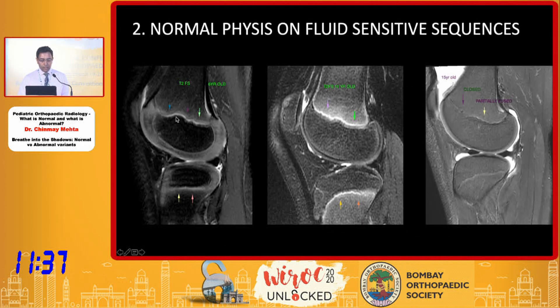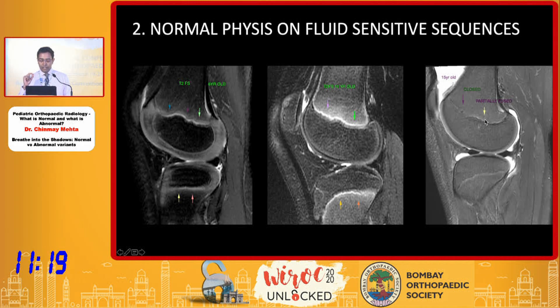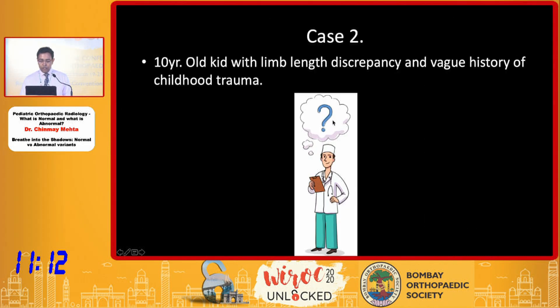This is the normal physis on a fluid-sensitive sequence — you see the trilaminar appearance with T2 hyperintensity. Even in a 6-year-old or 11-year-old the width or size of the physis is almost similar. Once it starts to close, the T2 hyperintensity wears off and the physis size goes on decreasing. The physis is contiguous — there is no interruption in the hyperintense line.